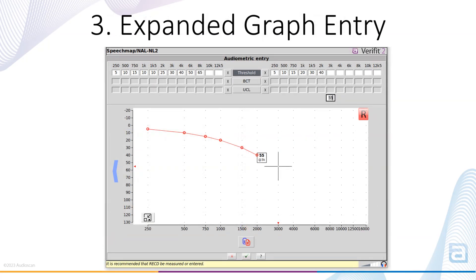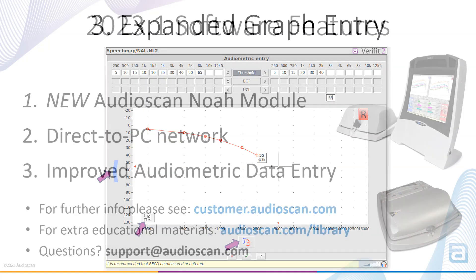The expanded graph entry has all the capabilities of clicking graph entry, however in this entry mode, a larger graph of a single ear is displayed. Once values are entered, the blue or red icons to the sides of the graph allow you to change ears. As in any other entry mode, the copy values to the other ear is also available here.